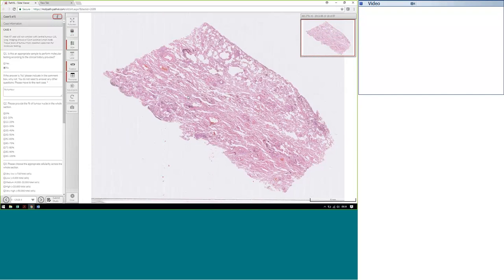Jane? I'd agree totally, and also a call to anyone sending tissue elsewhere to be tested for good clinical history to follow the tissue. That's all for that one, thank you. Okay, so I think that completes the lung study.